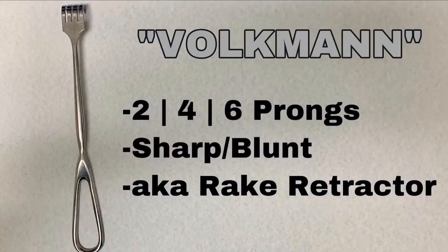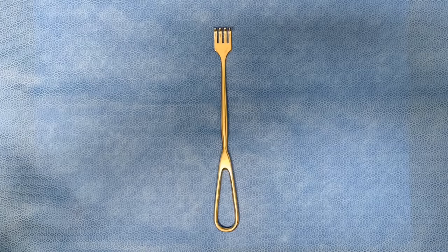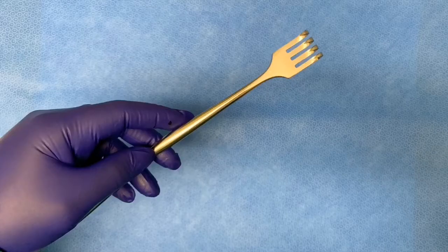This is the Volkmann retractor, also known as the rake retractor. It comes in sharp and blunt, and it can be two prongs, four prongs, six prongs, or even eight prongs.